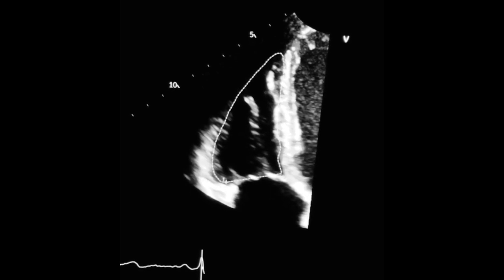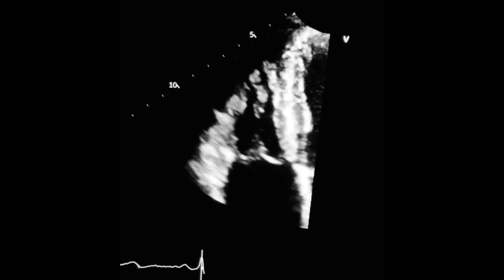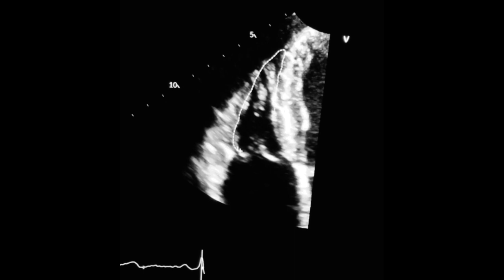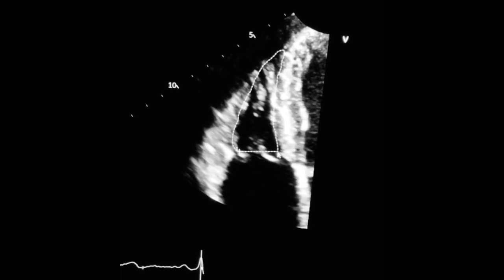Now that you have the diastolic area of the right ventricle, freeze the image at end of systole. Trace again the right ventricular area in systole, in the same way you did before. And that's it — with these two areas you will obtain the fractional area change.